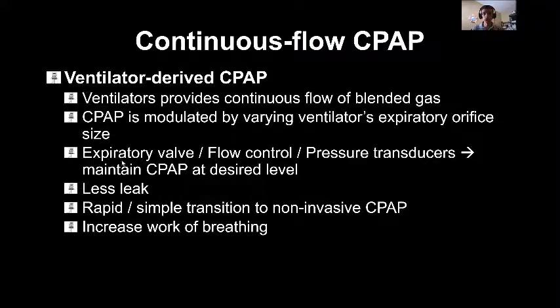So how you control the pressure from a ventilator is by the expiratory valve, and the other way is from the inhalation port of the circuit. If you provide more flow, because remember, pressure is a flow, and there is something blocking it.